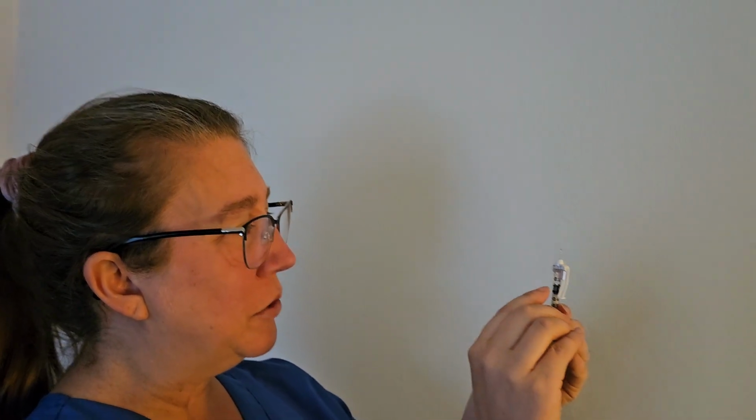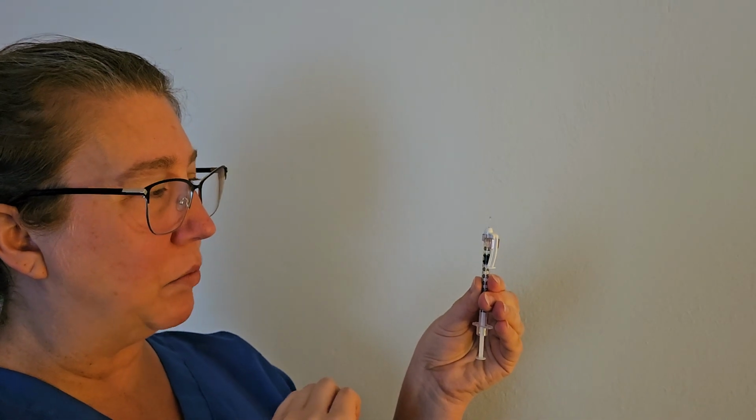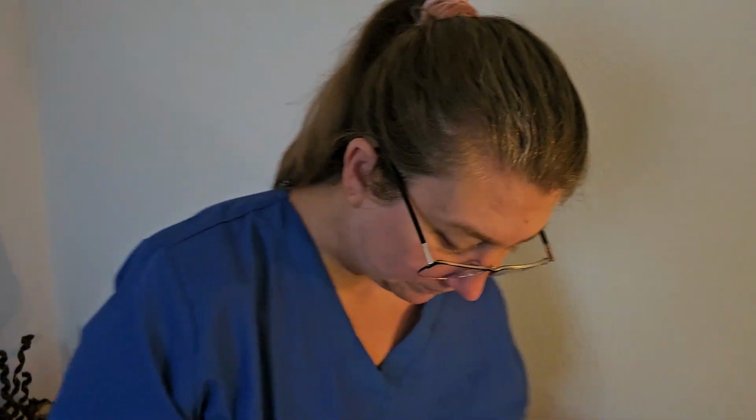But we're going to ensure that we still have the same amount of medication in the syringe that we need for our patient according to the order that we received. And we do. And that is proper.